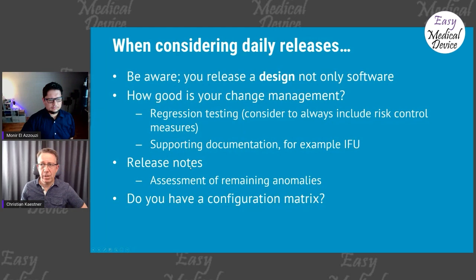Another stumbling stone when it comes to considering daily releases is assessment of remaining anomalies. When you change software and there are remaining anomalies, you need to justify why it's okay to release the software with known bugs. And not only that, also why they don't have a safety impact.